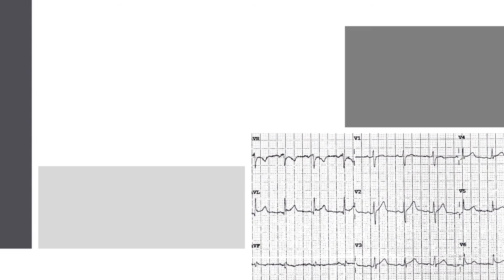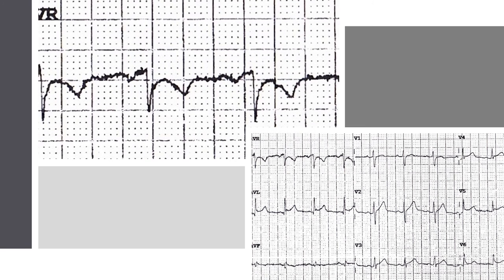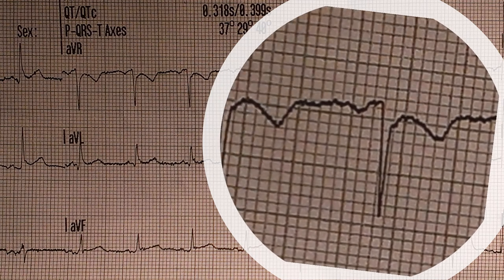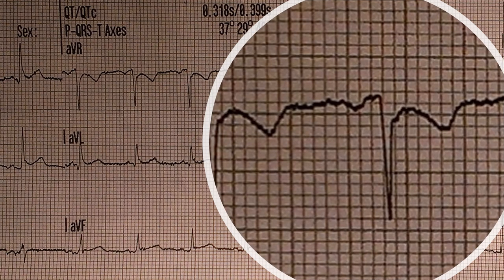Another example of an acute pericarditis ECG showing diffuse ST elevation and PR depression. Focusing on AVR again, we have the knuckle sign clearly visible. A third example also shows diffuse ST elevation, and focusing on AVR we can see a clear knuckle sign.